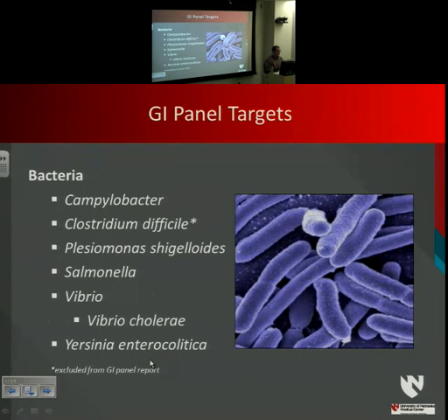Although Clostridium difficile is on the GI panel, it will not be reported. If a stool specimen tests positive for C. difficile using the GI panel, the ordering clinician will be notified by a microbiology fellow, and further C. difficile testing will be discussed.